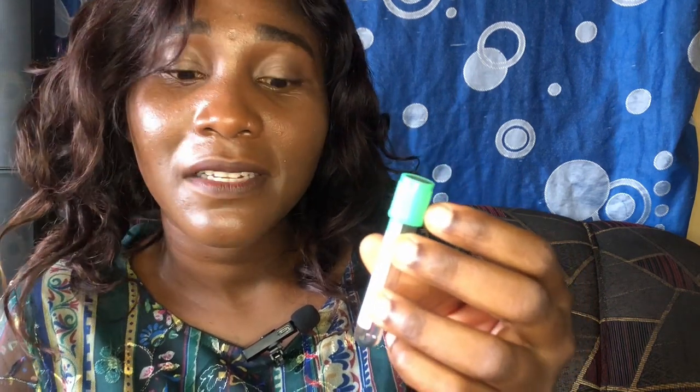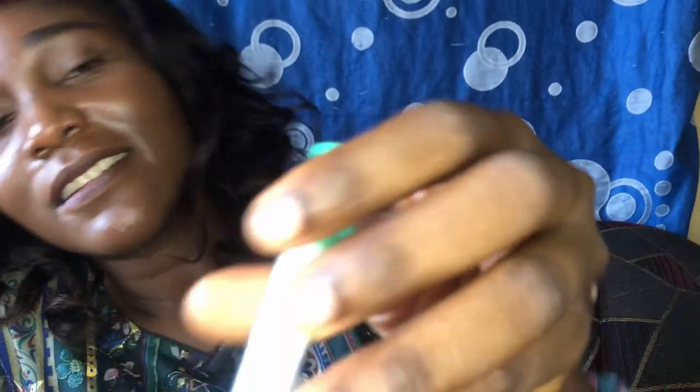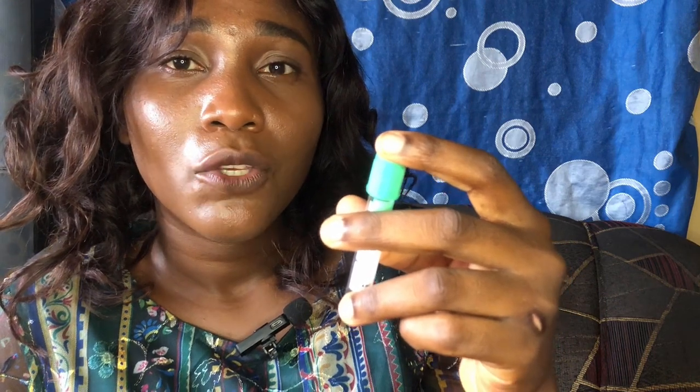Then we move over to this green tube. It is a heparin tube. The anticoagulant in it is lithium heparin, which it is coated with. You use it for troponin test, cardiomarker test, to check your ammonium level, your lactate level. But it's not usually common.